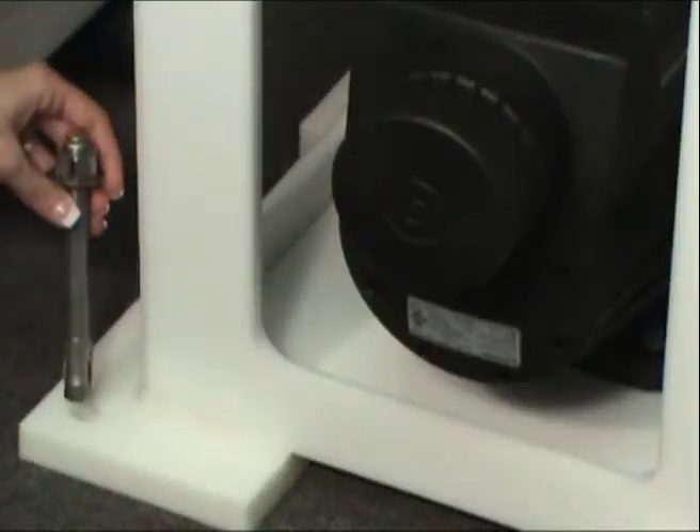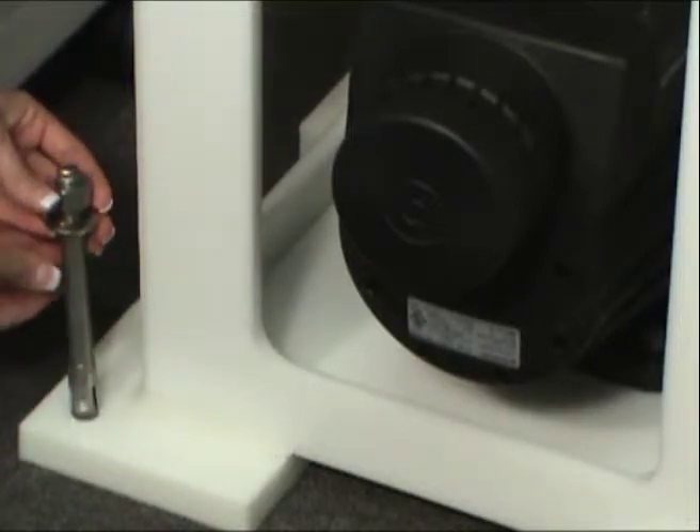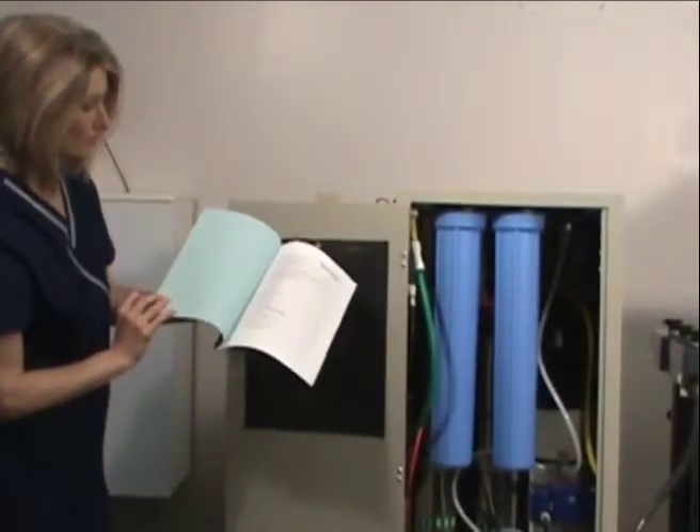After the storage tank is secured to the floor using the seismic bolts provided, the unit is ready to be connected. Complete installation instructions for the entire system are included in the manual inside the door of the RO unit.